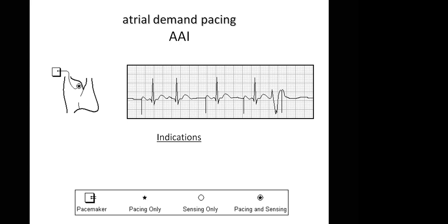And this happened, looking at the first QRS complex, then the second one seems to be an intrinsic one, well conducted. Then after that, we can see that there's a T wave, and the TP is getting prolonged. Then the pacer came in to pace it, and then we have a P wave, then a QRS complex again. Then the T wave coming again. Then it's as if the TP is being prolonged, then it's pacing again.